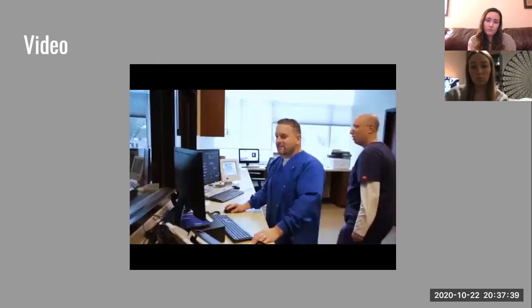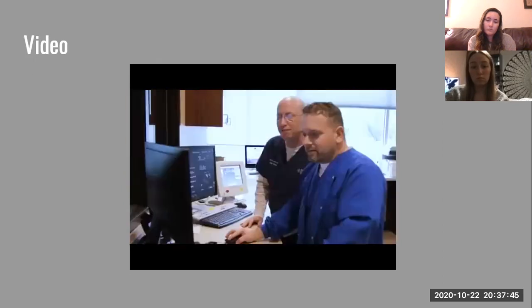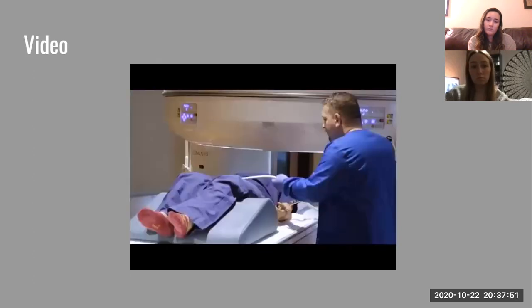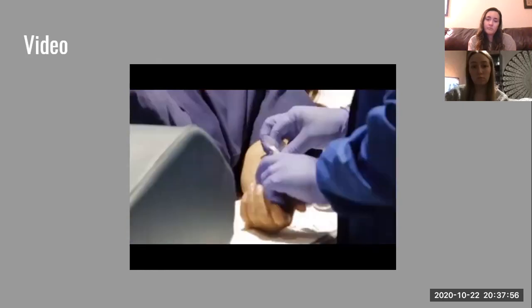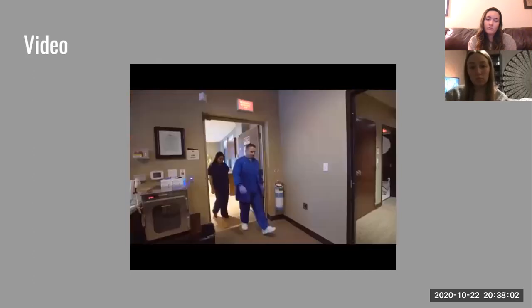Can we go over? Getting contrast takes a little longer. Can I see those sequences? Your total MRI may last 5 to 15 minutes more. Allergic reactions to contrast are rare. All right, how we doing? Although concern is always understandable and we need to be extremely cautious and careful in healthcare, we use them every day and they're critical to diagnosing your illnesses and making sure that you're healthy.